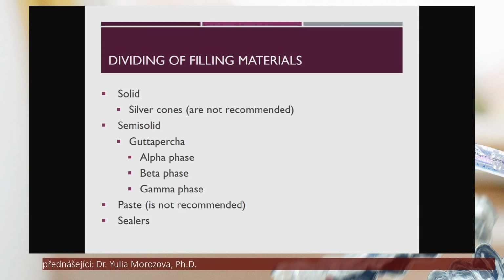They were widely used in something like the 70s up to the 80s of the 20th century. And nowadays they are not recommended. They had different sizes according to the size of root canals, and were put into the root canals with some paste. The next group is semi-solid, and here we can recognize the mentioned above gutta percha that could have different phases. In more detail we will speak about it in some minutes.